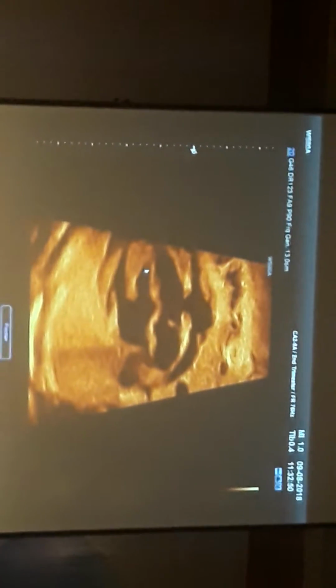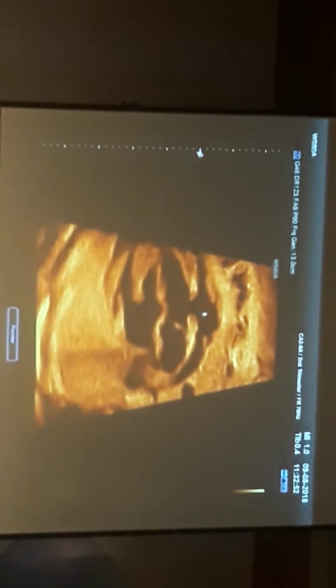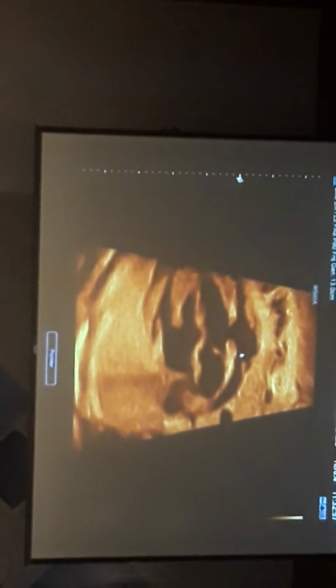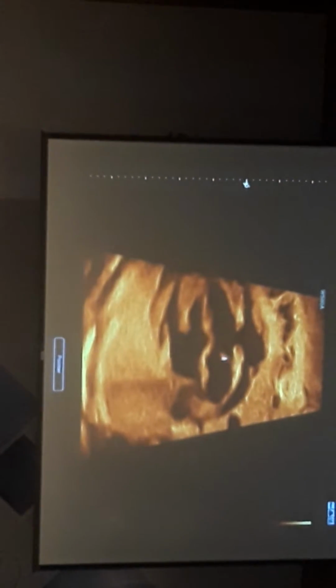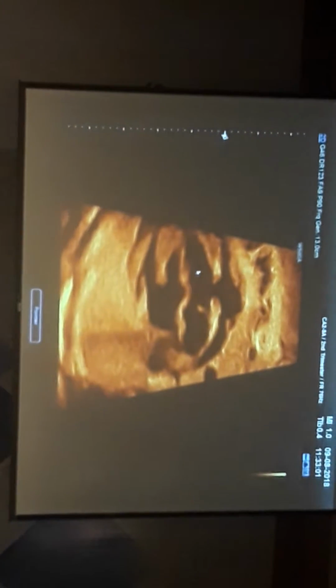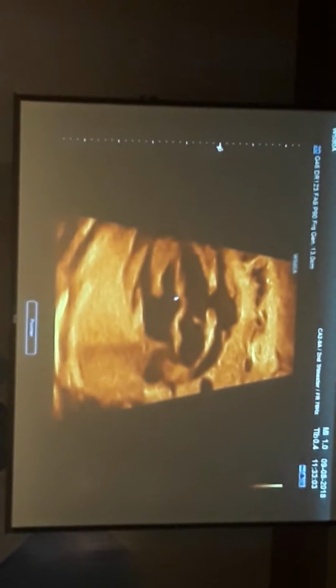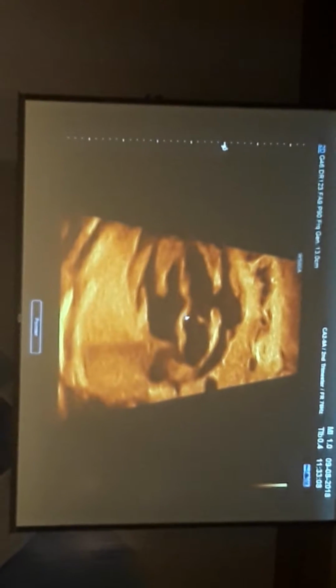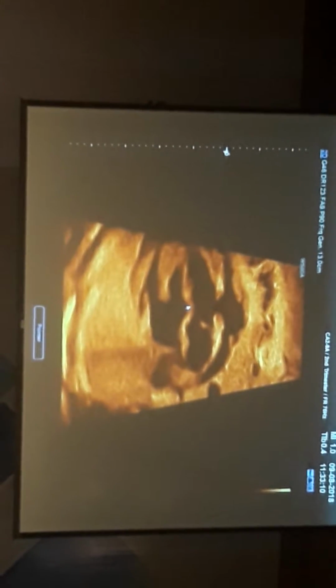Here's the left ventricle, smooth walled with a mitral valve. Tricuspid atresia with a hypoplastic right ventricle. Here's the pulmonary valve coming off the left ventricle. And remember, mitral pulmonary continuity here, because it's a left ventricle.